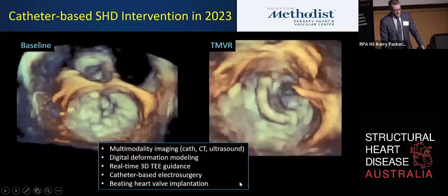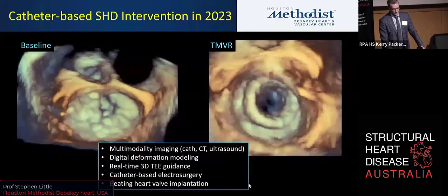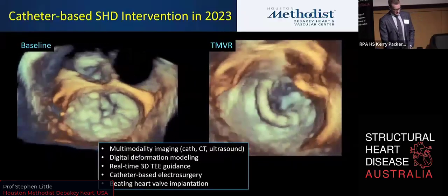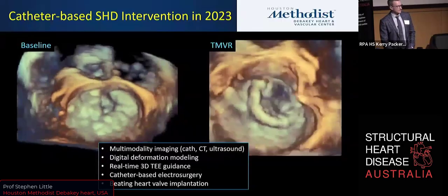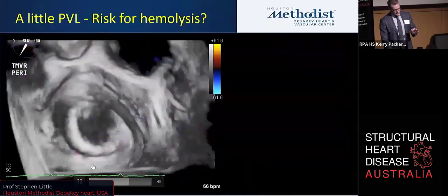This sort of summarizes multimodality imaging using CT, ultrasound, digital deformation modeling for the overlay and determination of the neo-LVOT, real-time 3D guidance, catheter-based electrosurgery, and beating heart valve implantation. I would like to show you a couple things here. So what are we finishing with?